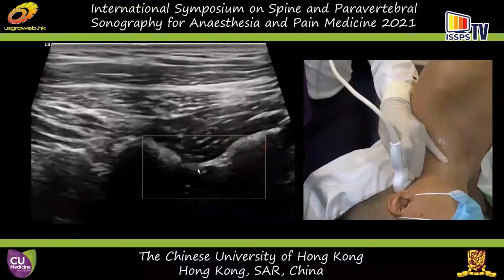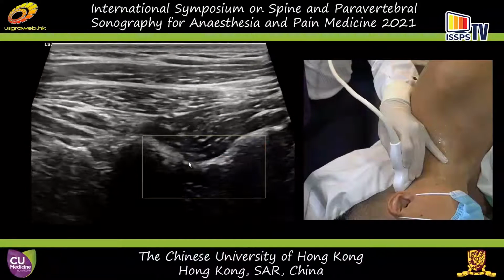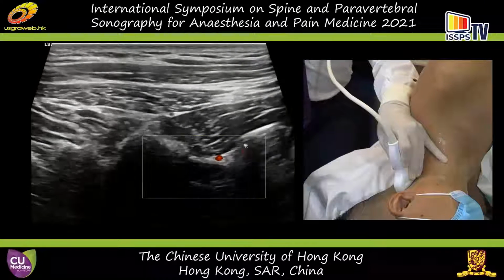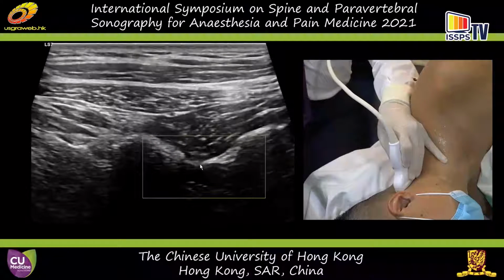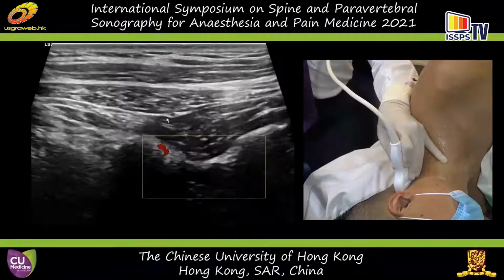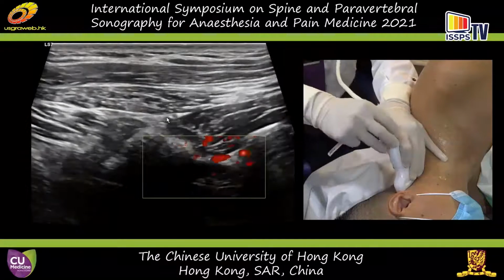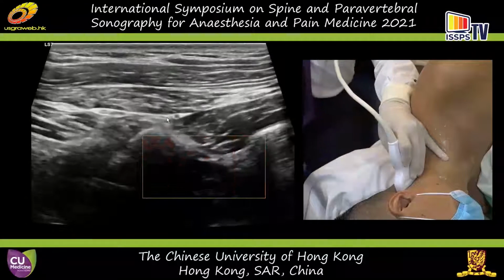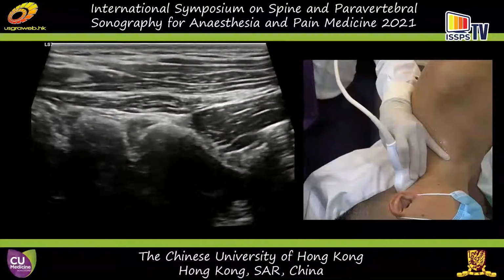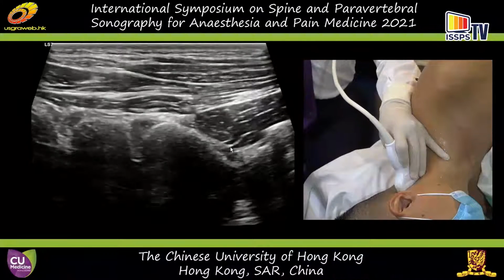And the C2 nerve root, remember, this is C1, C2, 3, C1-2 facet, which the C2 nerve root is underneath the C1. And then you can see the dorsal branch, the dorsal rami, will become the greater occipital nerve. And the ventral rami become the lesser occipital nerve. This time, I'd like to show you, in fact, this one here, this is the C2 nerve root.